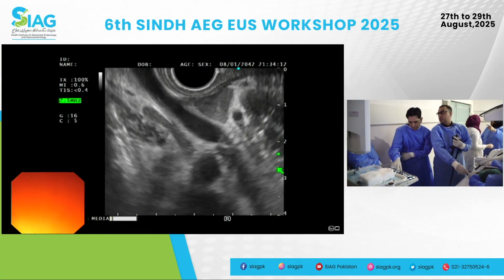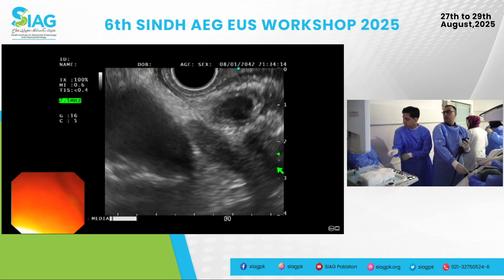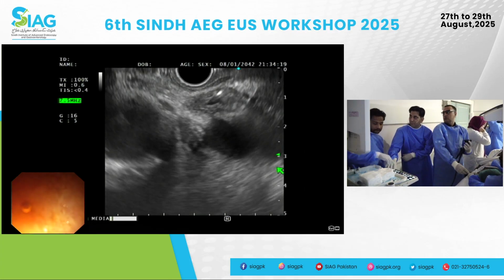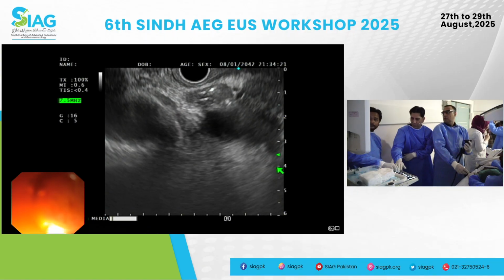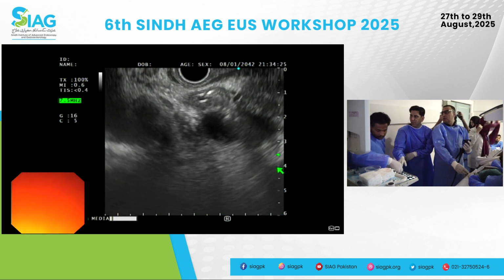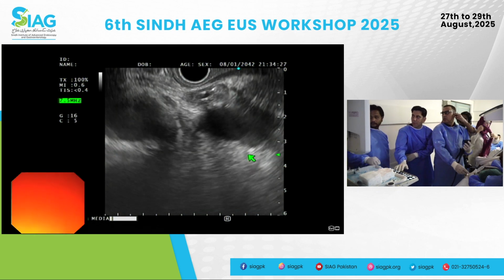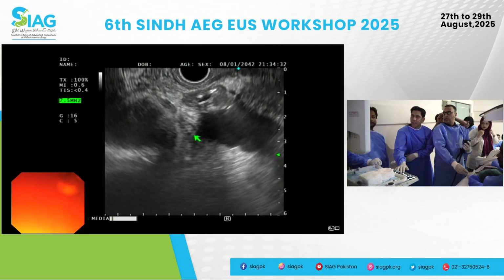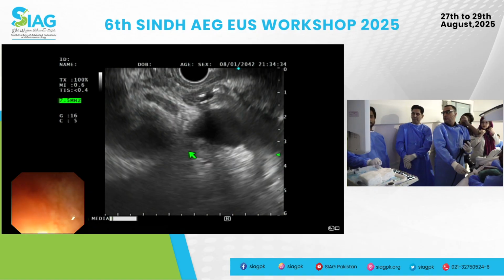We can see it. Pointer please. Pointer please. So zoom out a little bit, so we may have a better view there. That's better. It's not moving. Okay, good. So slightly thick-walled CBD containing a stent, with stent in situ.